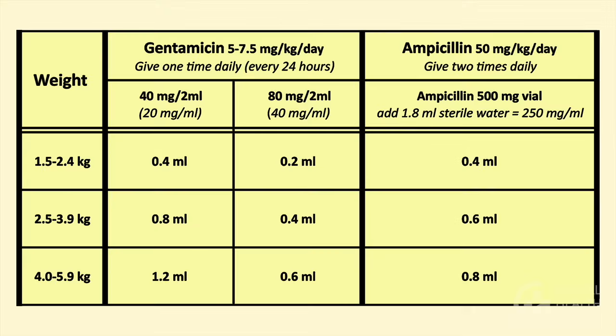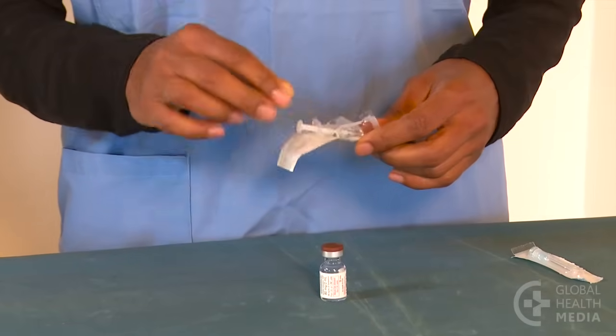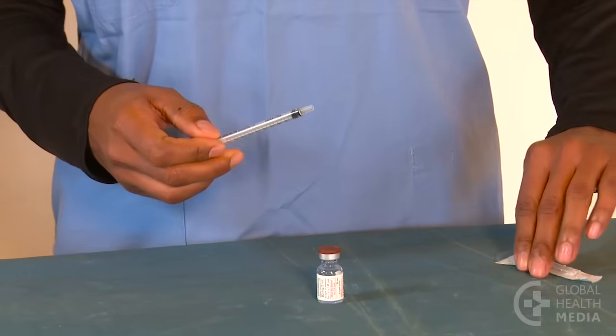The dosage chart shows that our 3.2 kilo baby needs 0.4 milliliters of this concentration. A 1 milliliter syringe will help your accuracy with the small dose.